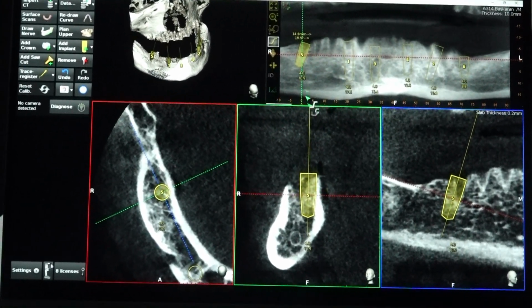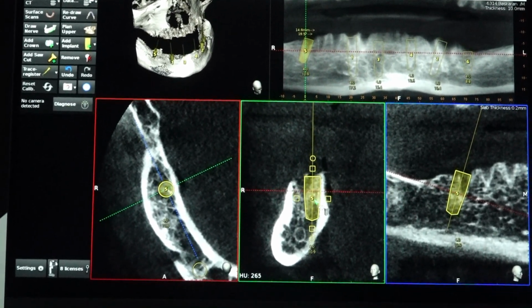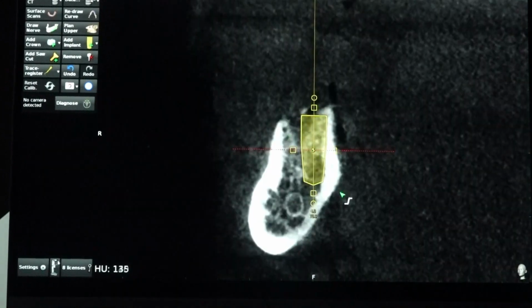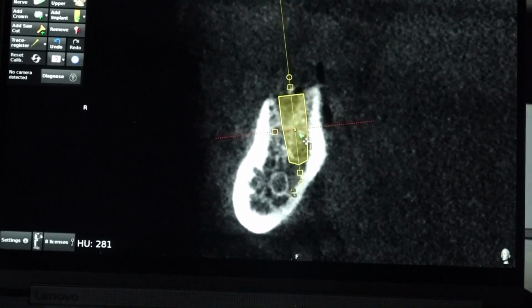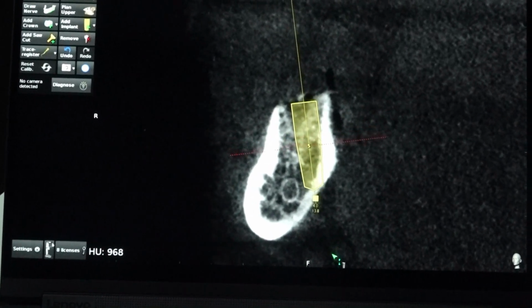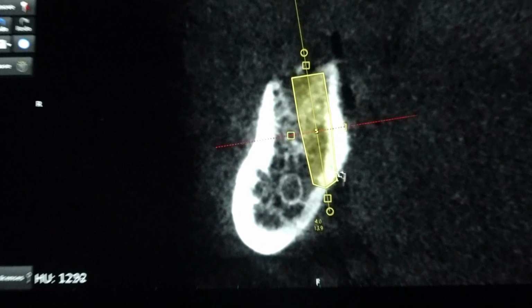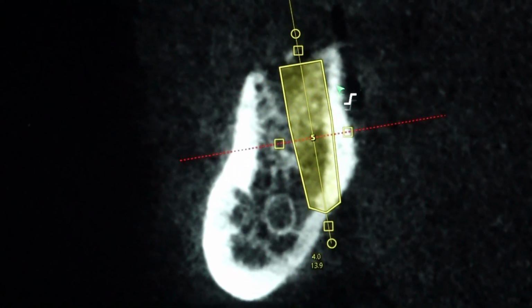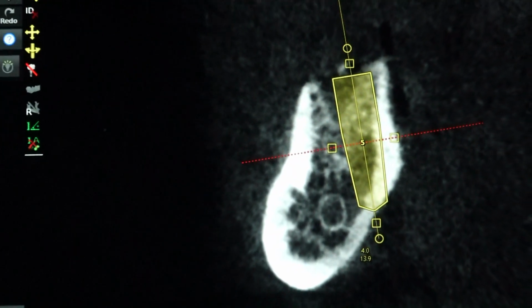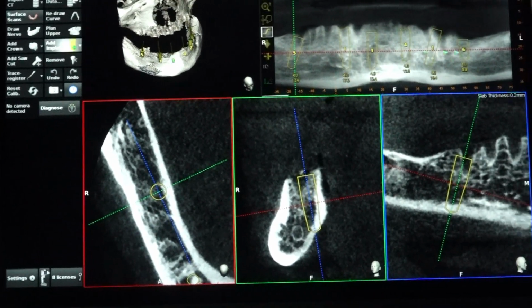See, I am starting from the distal root of 7, okay, and tilting slightly distally. You can see the myelohyoid ridge is very prominent, and you can even try lingual cortical engagement here. Okay, that will give more stability and support to the system. This is the second molar.